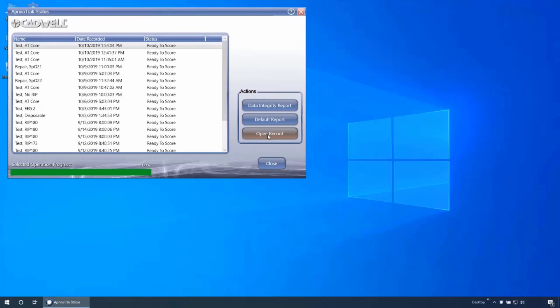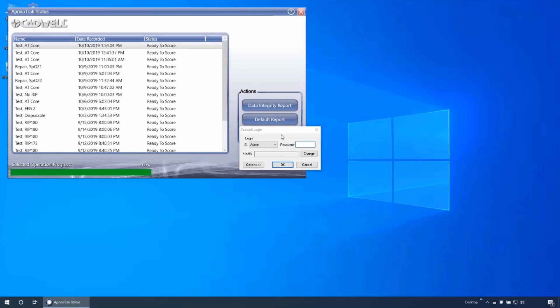After analysis is completed, the Default Report and Open Record buttons will activate. Clicking Default Report will run the report designated in the ApneaTrak settings menu without opening the study. Clicking Open Record will launch EZ3 and open the recording for review and or scoring.